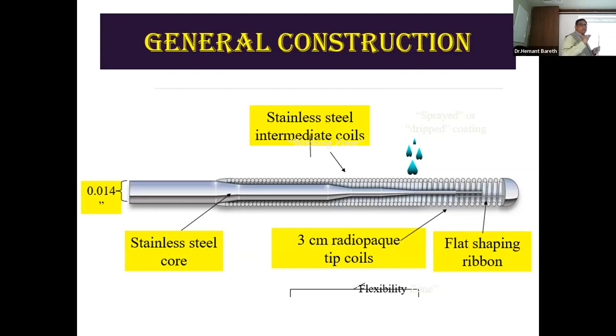Importance of a tapering wire: there you require a lot of tip support. What happens is you apply pressure on this big 014 wire, but the tip has increased pushability because it is tapered. And so it can penetrate through even tough lesions. You might even penetrate through fibrous lesions.